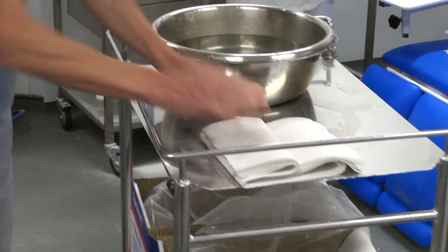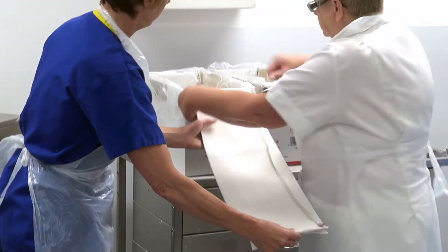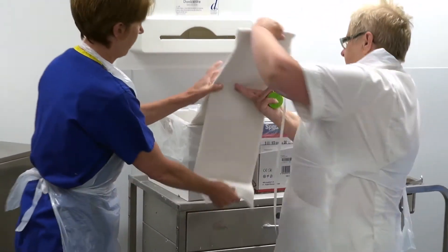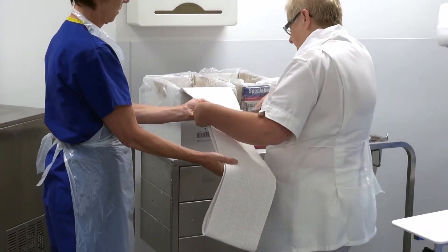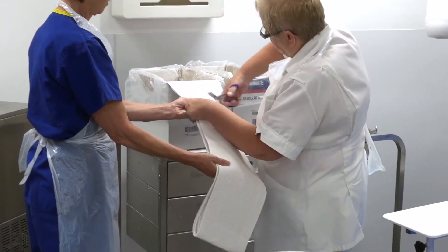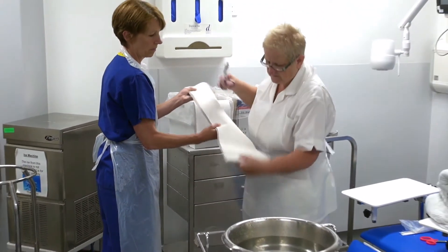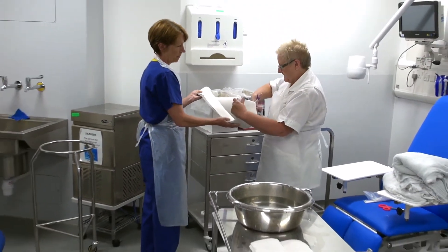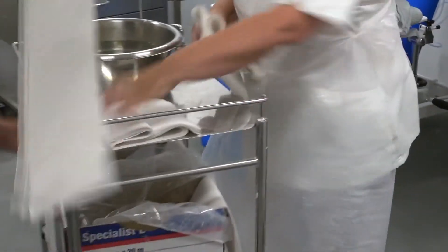There we go. I'm going to double this — doubling it over. Just take one. Now we have our three slabs ready to go.